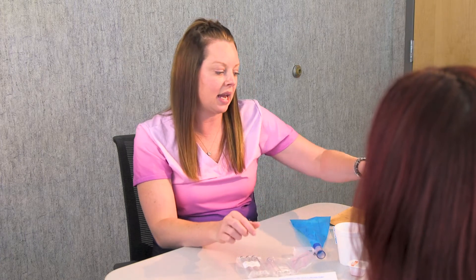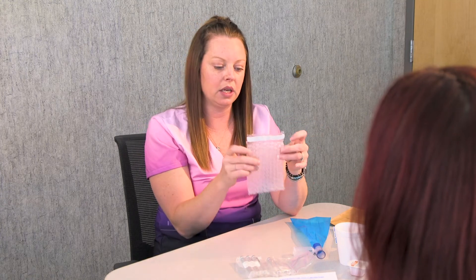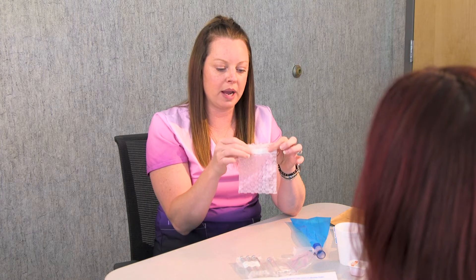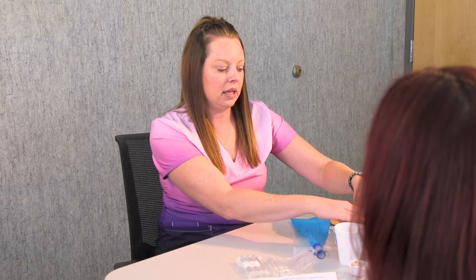You're going to pack everything back in. Place your tubes into the plastic holders, take the sticky off, and wrap it around. Drop them in the box, close it up, and when you're finished, drop it off at our office.